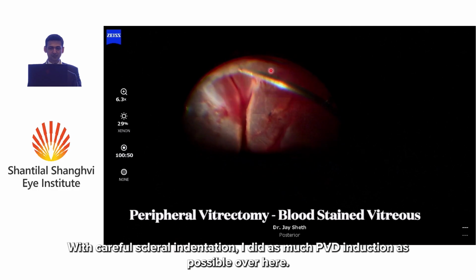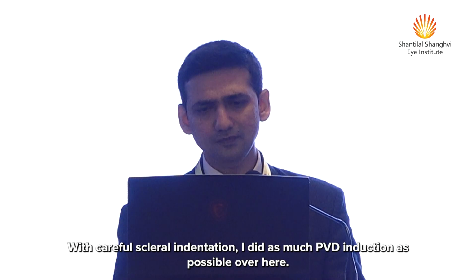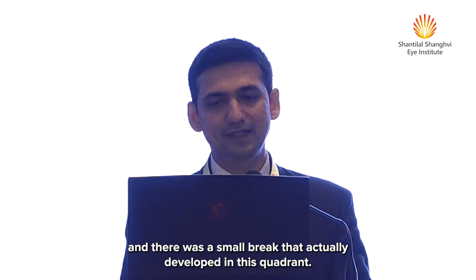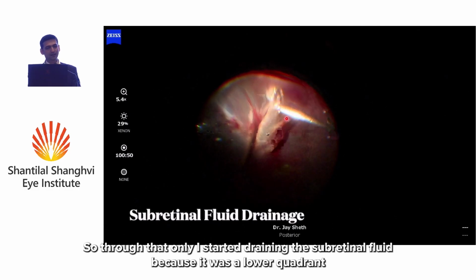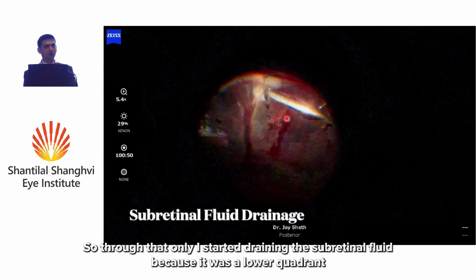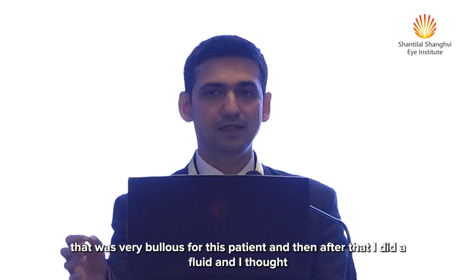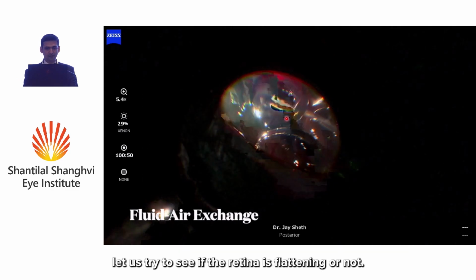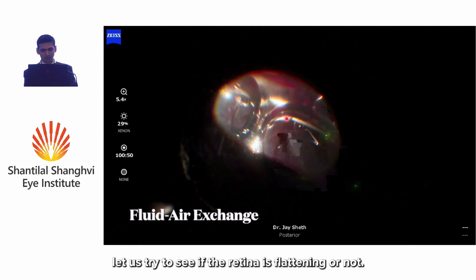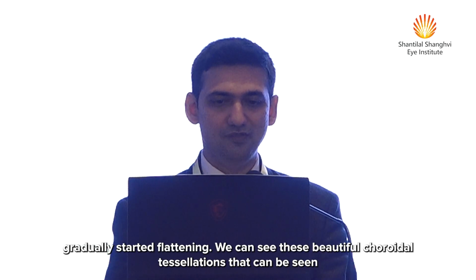With careful scleral indentation, I did as much PVD induction as possible here, and a small break actually developed in this quadrant. Through that I started draining the subretinal fluid because the lower quadrant was very bullous. Then I did a fluid-air exchange to see if the retina was flattening or not. At this stage I was lucky that the retina gradually started flattening.